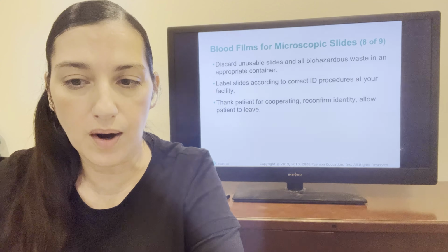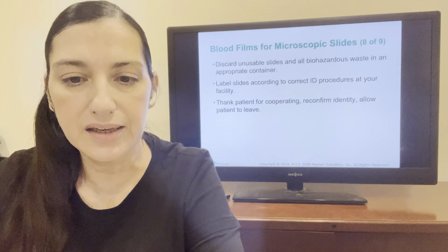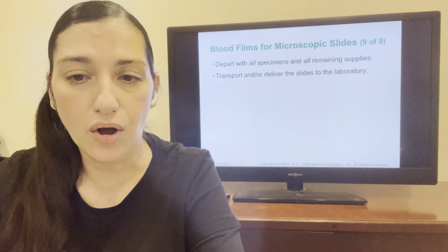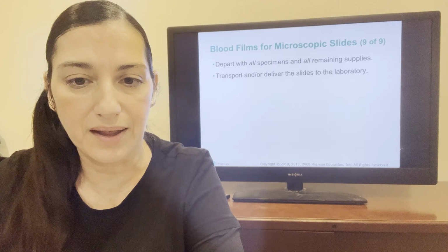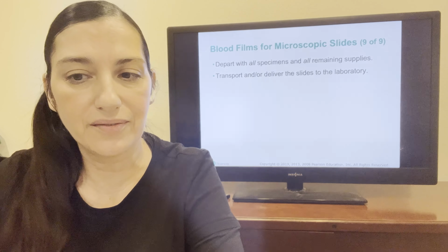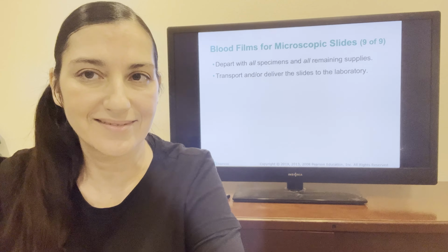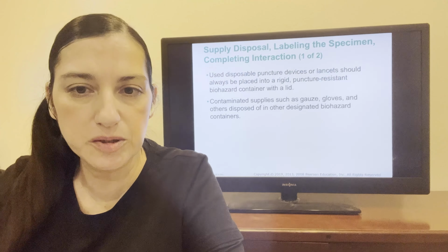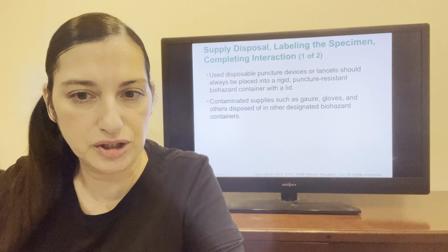Thank the patient for cooperating, reconfirm identity, and allow the patient to leave. Depart with all specimens and all remaining supplies. Transport and/or deliver the slides to the laboratory. Supply disposal, labeling the specimen, completing the interaction.